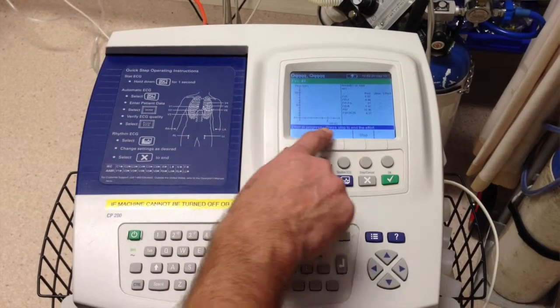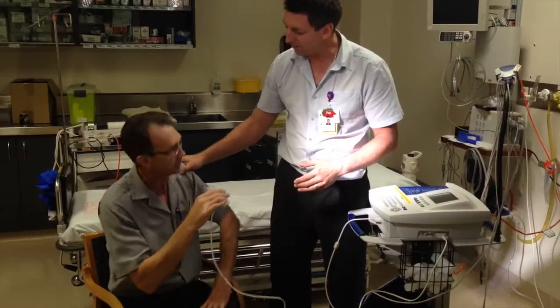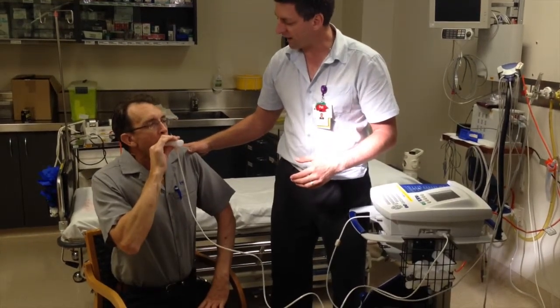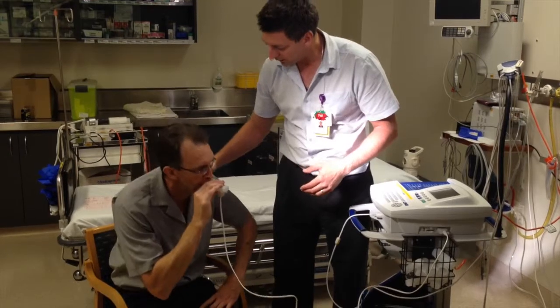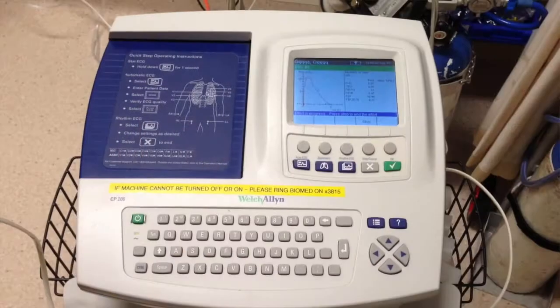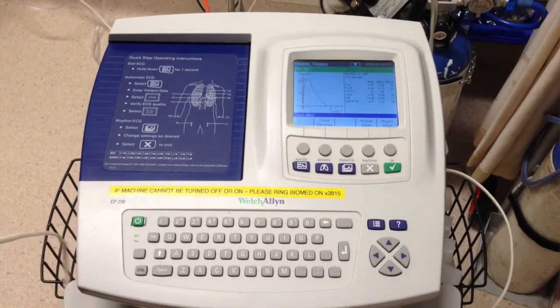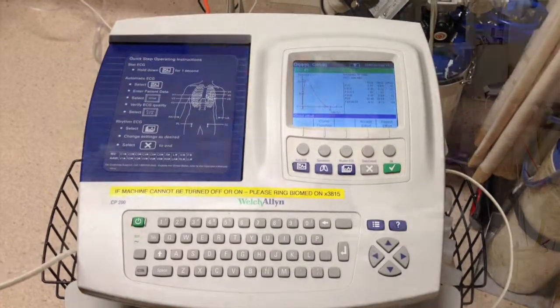The machine's ready to go. Now go — okay Derek, big breath in, turn around and blow out as hard and as fast as you can. Go, blow, blow, blow, keep going, keep going, go go go go — and then press stop when you're finished. Well done, good boy Derek!